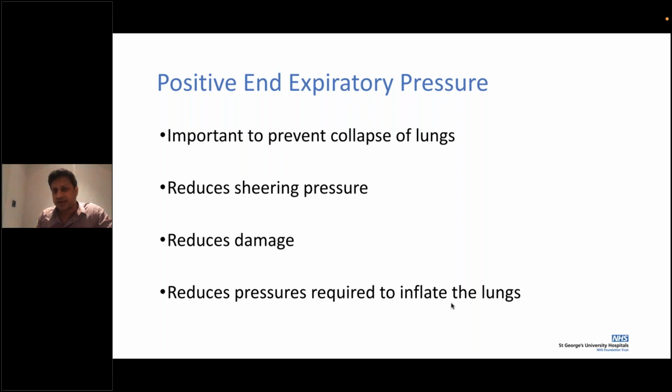And even when you're extubating a baby, what we tend to do is set your PEEP, and keep your endotracheal tube until the last minute. Keep your non-invasive support covering your nostrils. Start that, and only then you take your endotracheal tube, because you don't want your alveoli to collapse. You want that extubation to be successful, and ensuring that there is effective gas exchange.